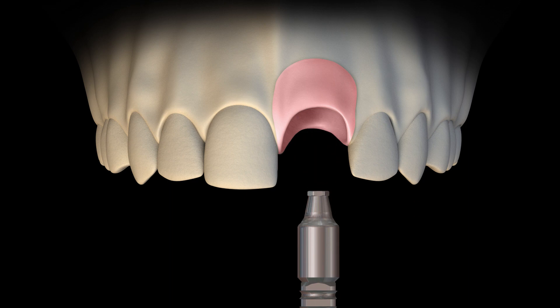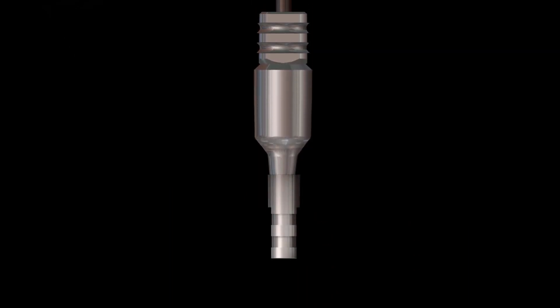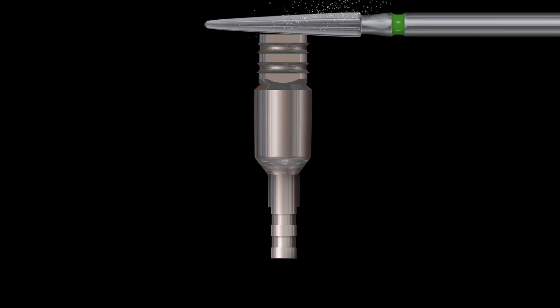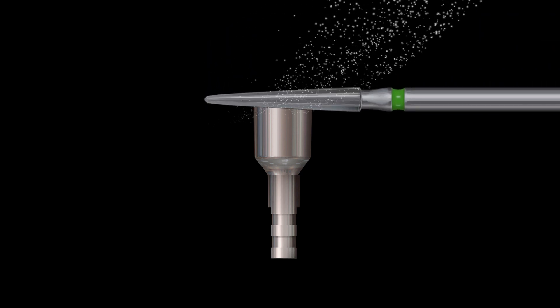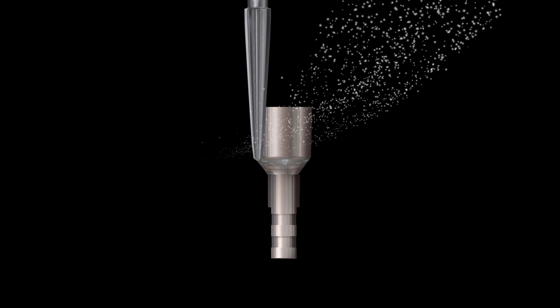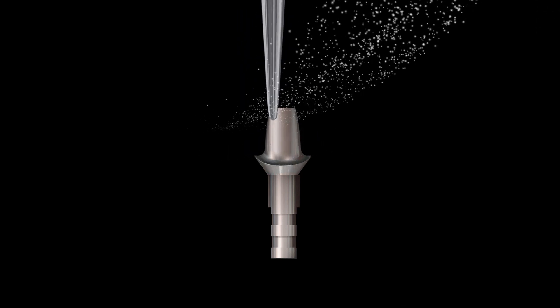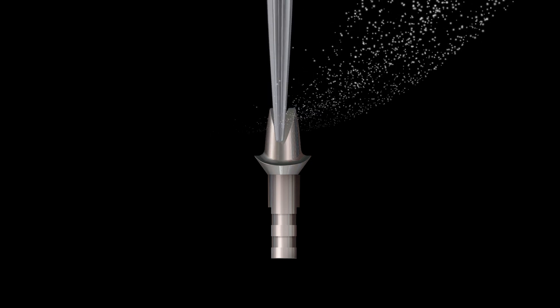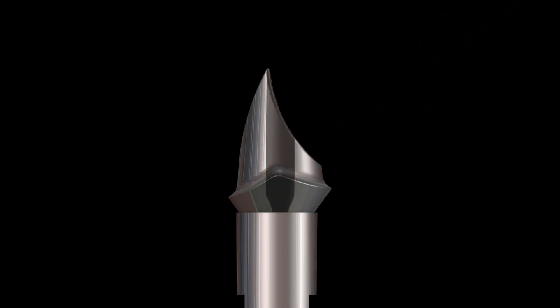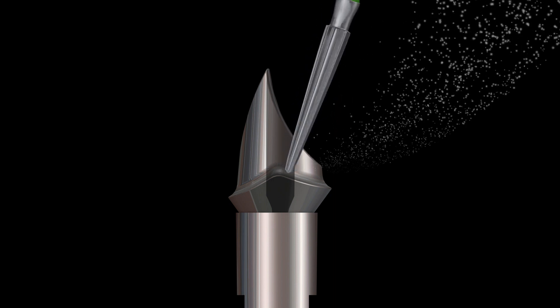Remove the multi-purpose abutment from the stone model and attach the multi-purpose abutment to the analog. Use a carbide bur to shape the multi-purpose abutment, then use a carbide bur to create a slot for an angled ball tip screwdriver.